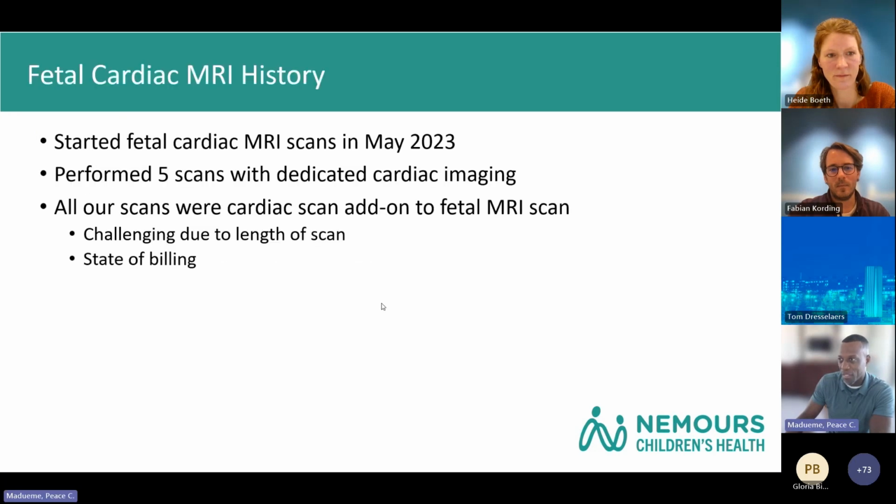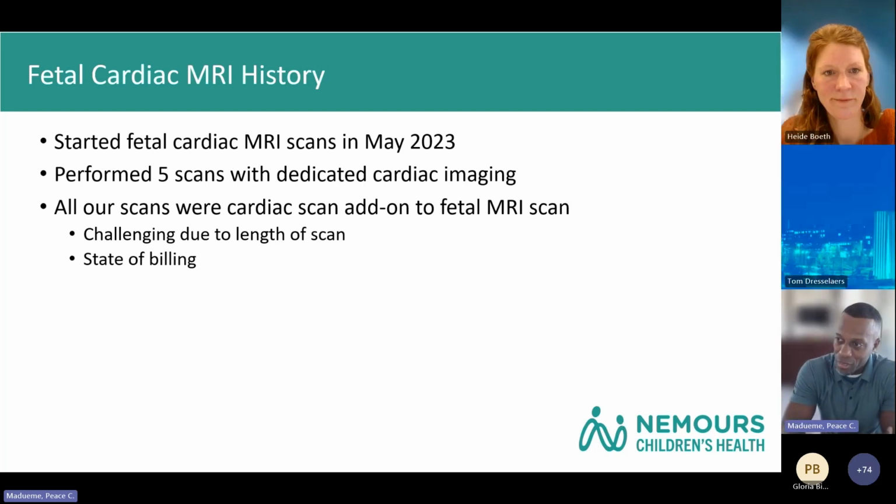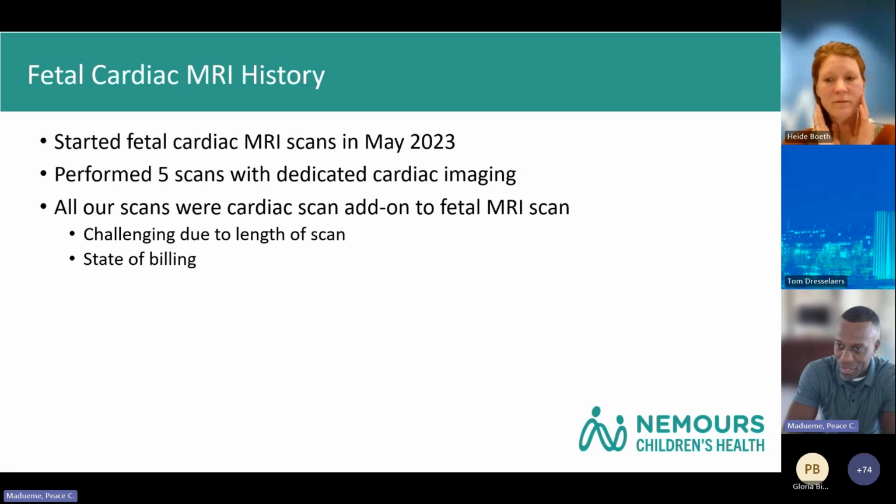From a fetal cardiac MRI history standpoint, we started in May of 2023. We've done about 5 scans with dedicated cardiac imaging, but that imaging was at the tail end of a regular fetal MRI scan. So all our scans are cardiac scan add-ons to fetal MRI scans, which I believe are what most people are doing. I'd be interested to hear if anyone is doing just specific fetal cardiac MRI scanning, especially in the US, and if they're able to bill for that. Obviously, the challenge is the length of the scan when you're tacking it onto a fetal MRI scan, as was just mentioned.